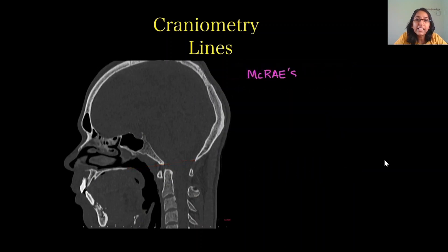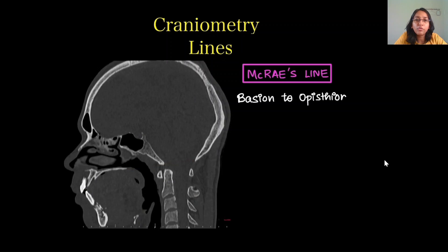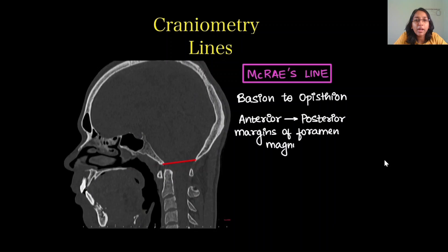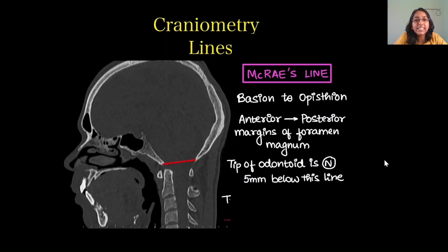Next we have McRae's line, which joins from the basion to the opisthion — these are the anterior and posterior margins of the foramen magnum. Normally, the tip of the odontoid is 5 mm below this line. If the tip crosses this line, it indicates basilar invagination.